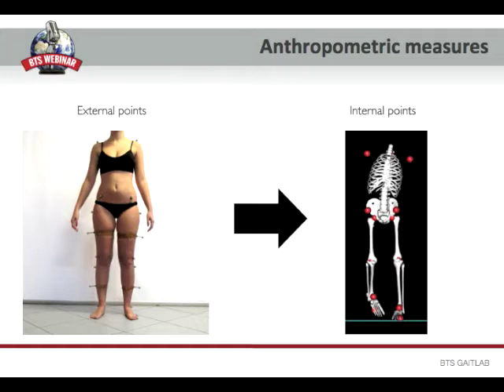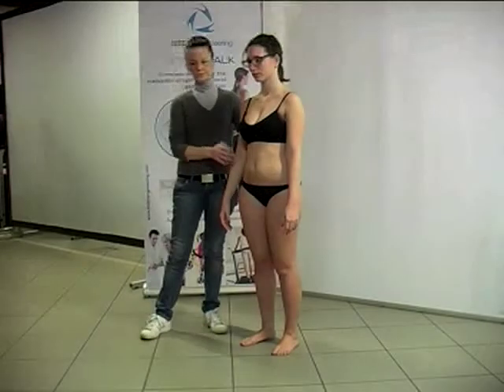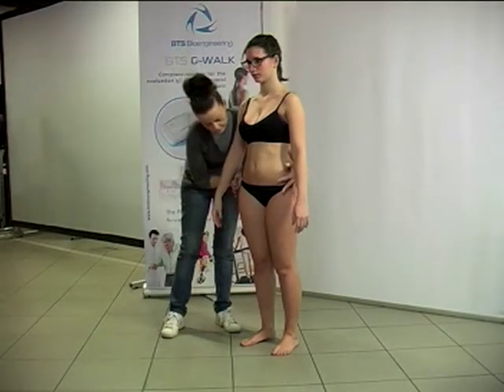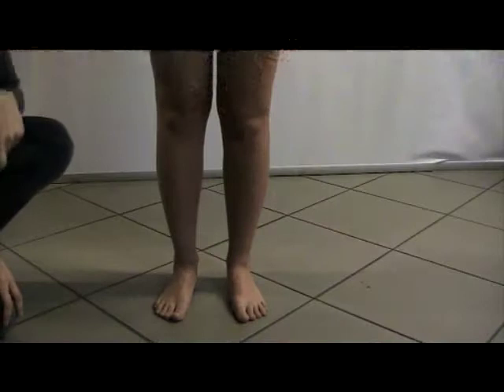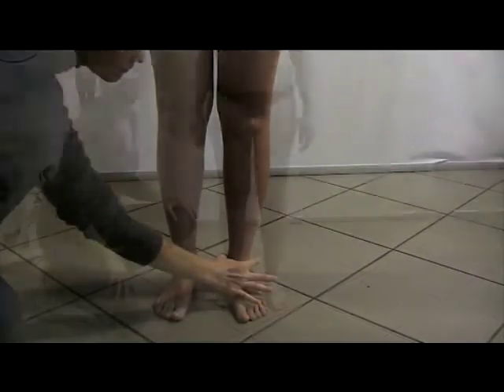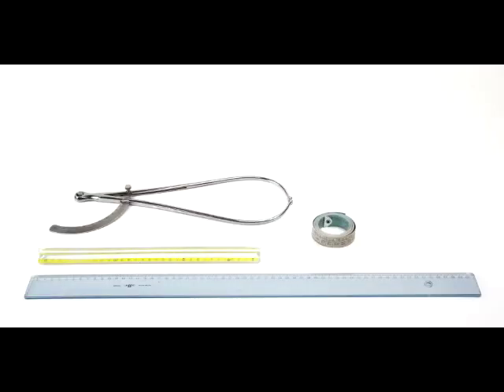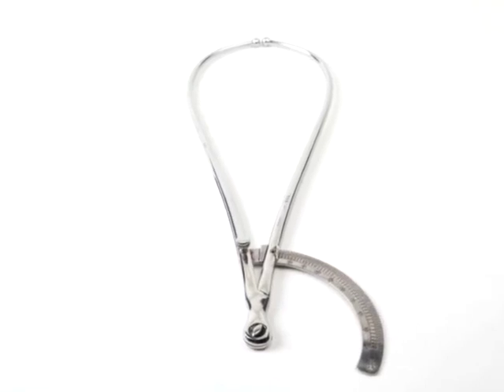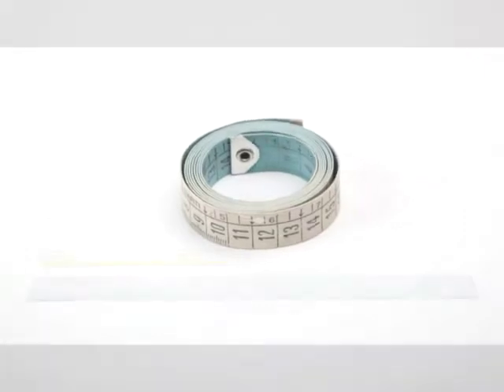We start from the markers that are external points to arrive at the joint centers of rotation that are internal points. The anthropometric measures are the weight and the height of the subject, the pelvis width, the pelvis depth for both sides, the diameter of both knees, the diameter of both ankles, and the length of both lower limbs. The tools we need for the measures are a pelvimeter, a meter, and two rulers.